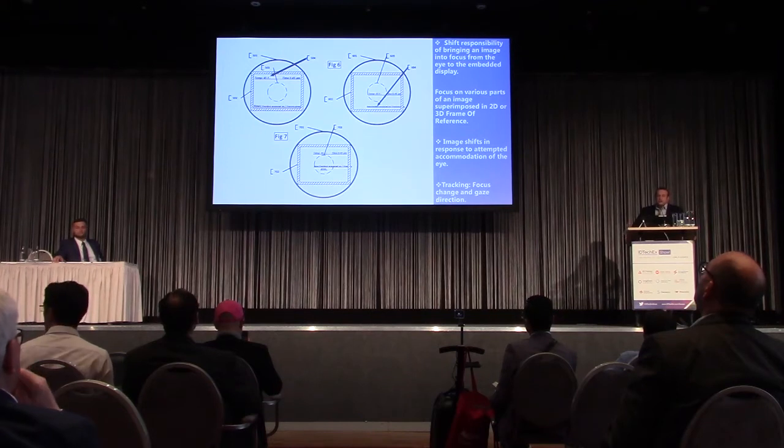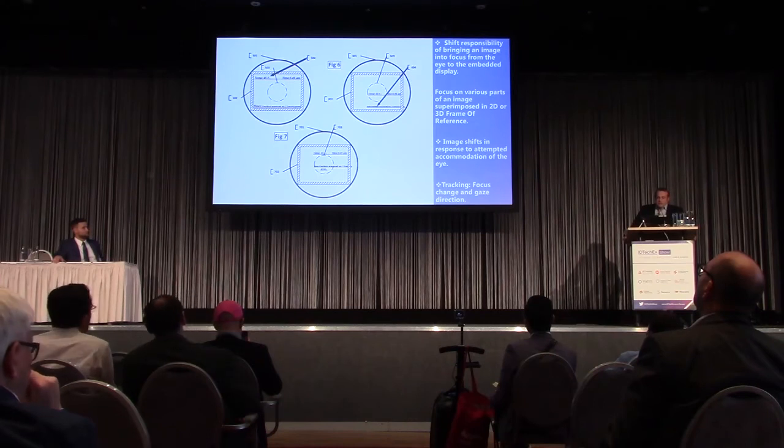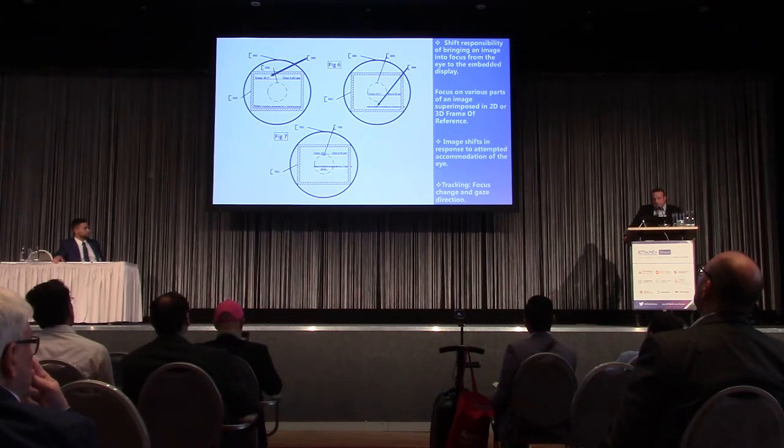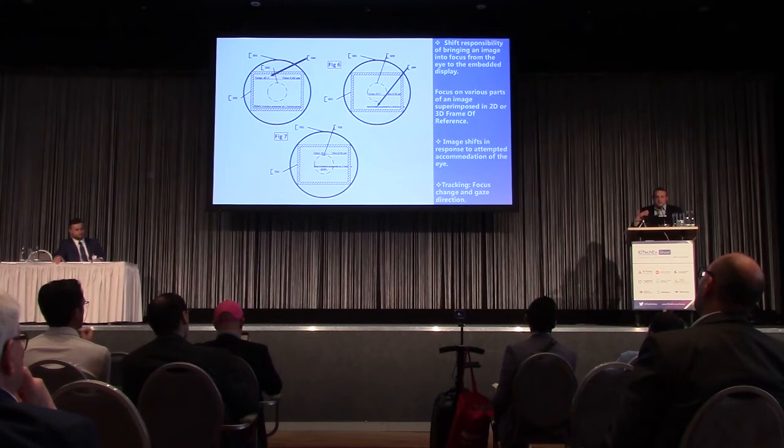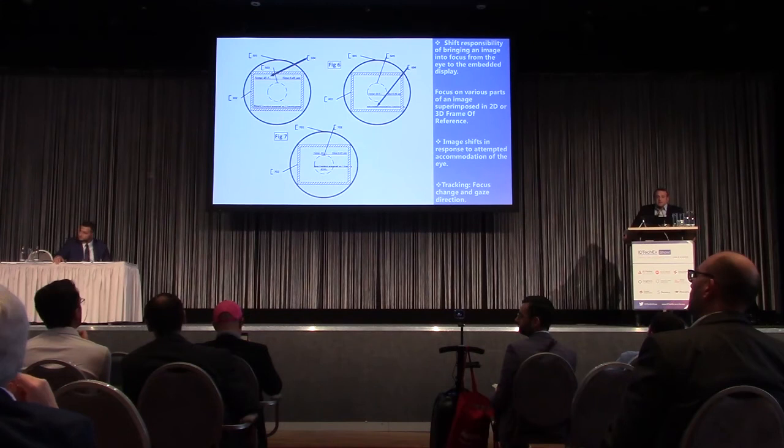And the user looks through the lens at an external object. If you look at the fat arrow 504, it indicates the point of interest of the user, detected by the smart contact lens system as attempted accommodation. In order to detect that, the user had to change focus and start moving his eyes to the upper left corner in an attempted accommodation.